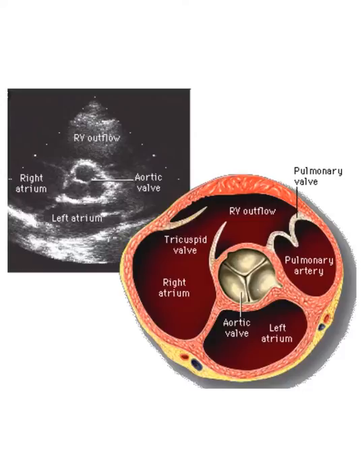And then obviously when you use your Doppler signal, you're going to want to sample through the tricuspid valve to see if there's any tricuspid regurg, and through the pulmonary valve to see what the velocity is. Then you will look at the atrial septum, though I don't recommend it as a diagnostic tool, to see if there might be any atrial septal flow coming up here in a big flame. It is not perfect. If the ASD is pointing up towards the tricuspid valve, you might see it pretty well, but it's not definitive, so the subcostal is the way to go with that.